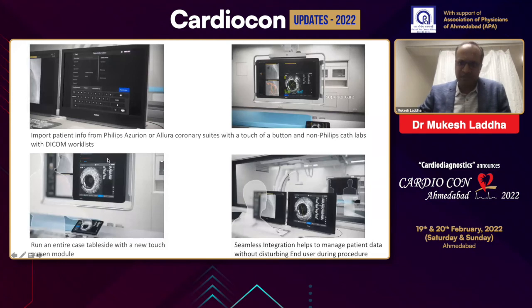And this is the inside of the cath lab, where the whole monitor is attached to the screen, where you can see your coronary angiogram as well as IVUS images at the same time in real time. And this is again outside, at the console, where you can see images, you can show them to your patient also, as well as interpret them after doing your angioplasty.